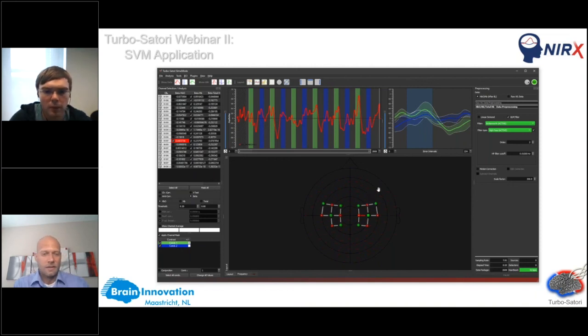Okay, great. This one actually dates back to last week's talk, and specifically about the demo that I was a part of. But could you give more details on how to optimize the neurofeedback threshold for each participant, and how you would go about doing that?